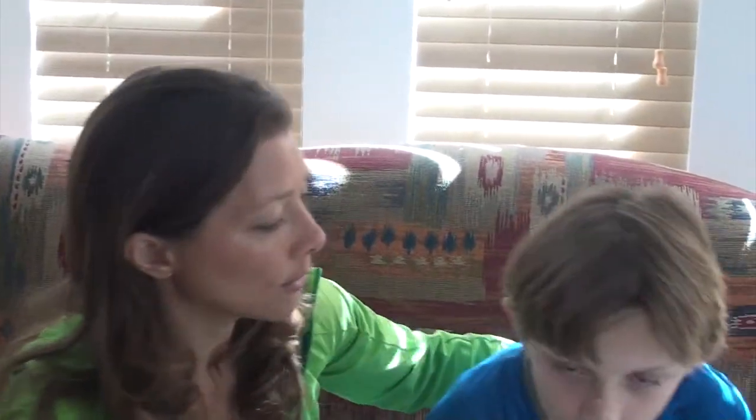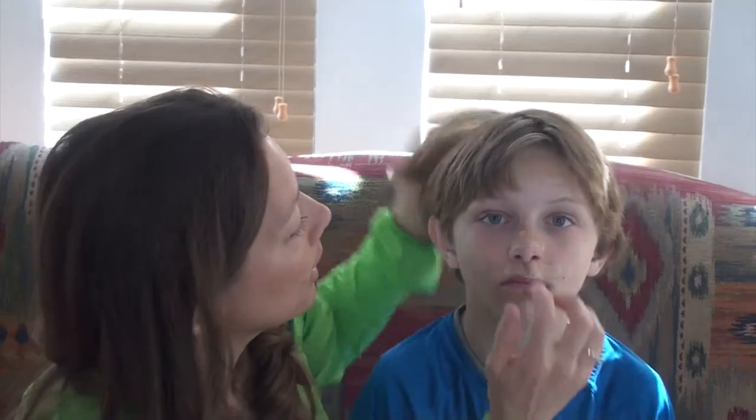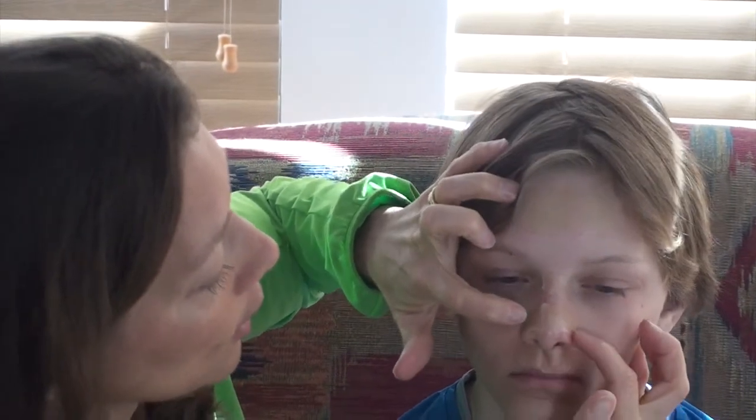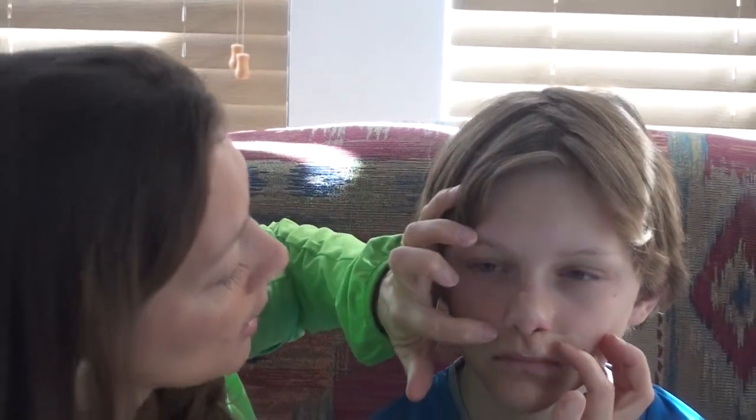I just cut them to fit the size of the burns, and so you can see right here — we took one, and this is a big, broad one to go across his forehead, and then we took another one, cut it short to go across the bridge of his nose, this one across his nose, and this one across his top lip.